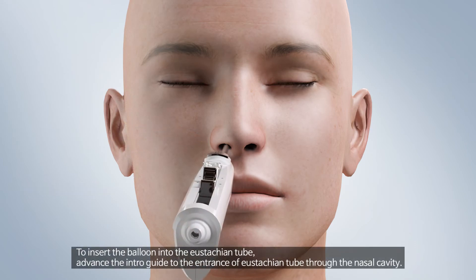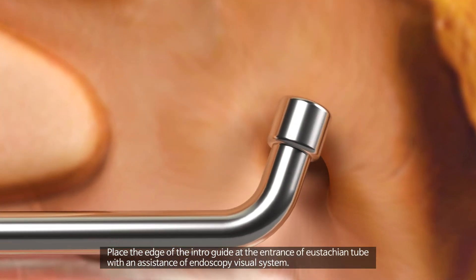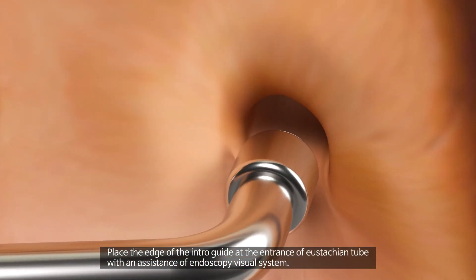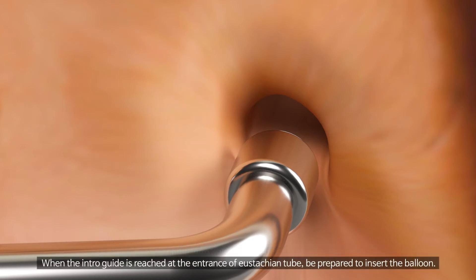To insert the balloon into the Eustachian tube, advance the intro guide to the entrance of the Eustachian tube through the nasal cavity. Place the edge of the intro guide at the entrance of the Eustachian tube with assistance of an endoscopy visual system. When the intro guide has reached the entrance of the Eustachian tube, be prepared to insert the balloon.